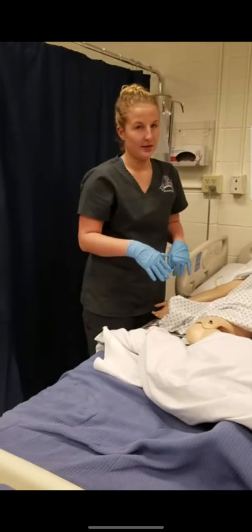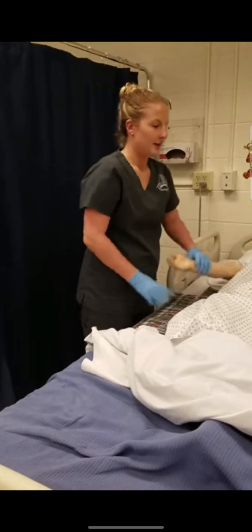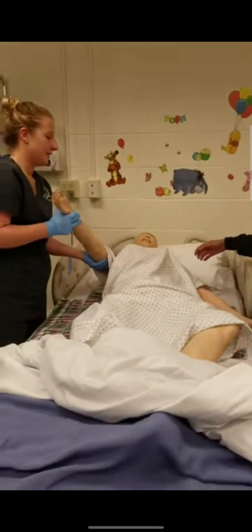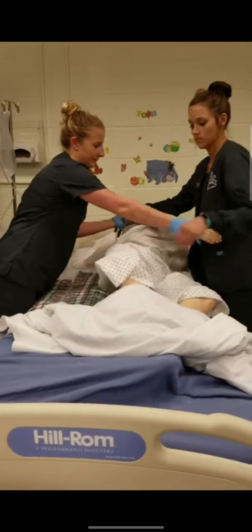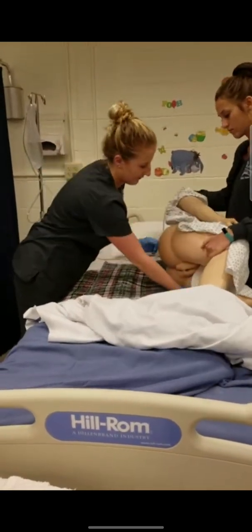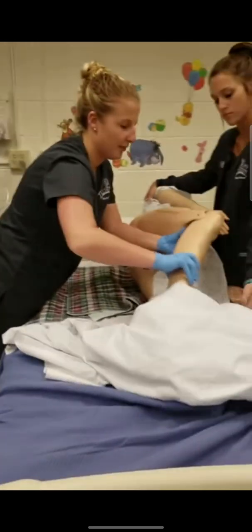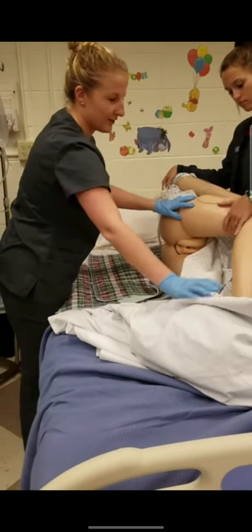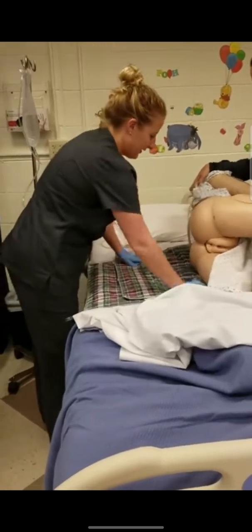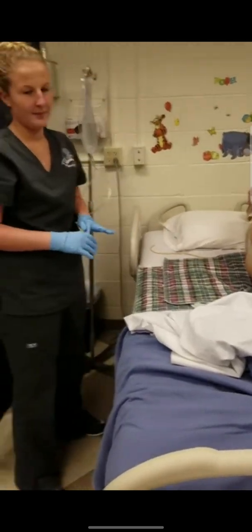I will have all those supplies properly ready before we do the enema. Then I will have them roll over on their left side with their top right knee bent and flexed forward. I will make sure their pads are underneath them.